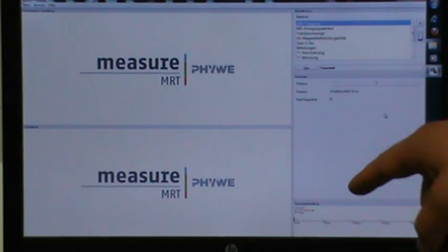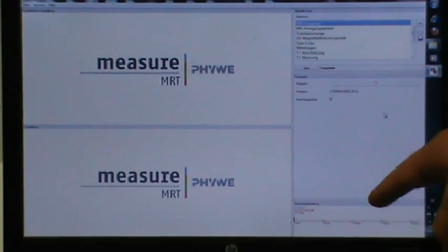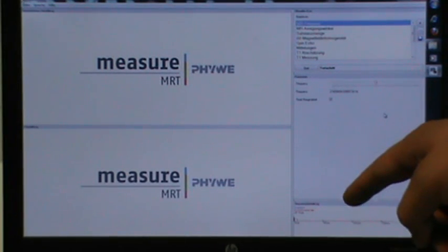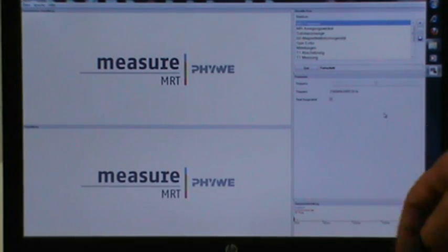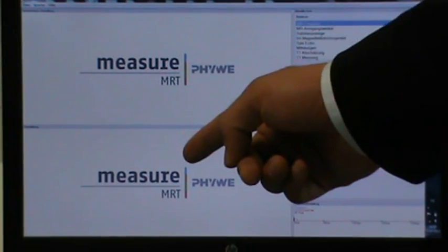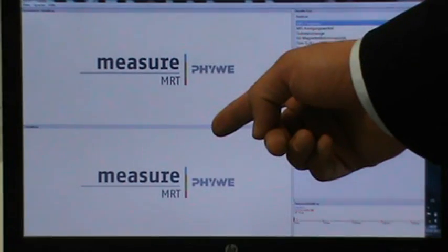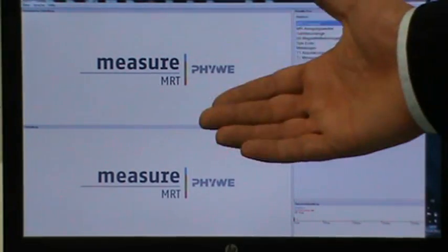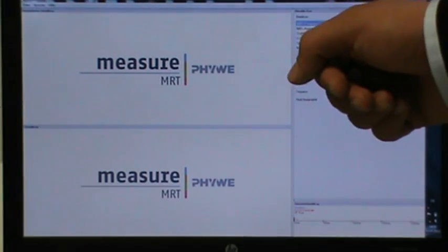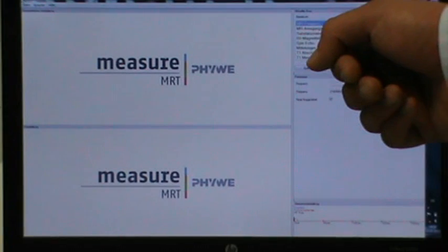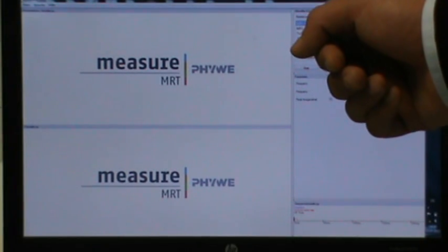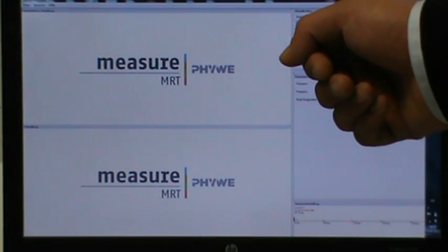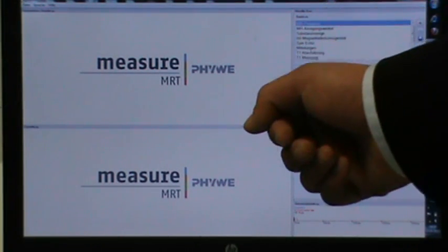The sequence section displays the sequence that is used for the selected experiments, while the results section just displays the results no matter whether a rather theoretical experiment or an experiment with a concrete MR image is under investigation.